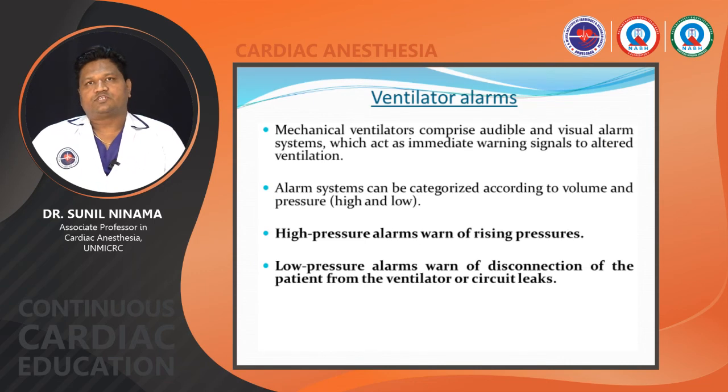That is, you have to always look for the ventilatory alarms. The mechanical ventilator comprises audible and visual alarm systems, which act as immediate warning signals for altered ventilation. The alarm systems can be categorized according to volume and pressure. The high pressure alarm warns of rising pressure, and the low pressure alarm warns of disconnection of the ventilatory circuit.